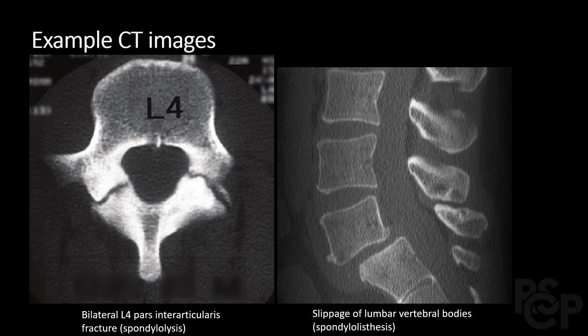Here are some example CT images. On the left we have a case of spondylolysis, as evident by the bilateral pars interarticularis fractures, leading to an unstable fracture. This fracture over time can lead to spondylolisthesis, which is slippage of one vertebral body over another.